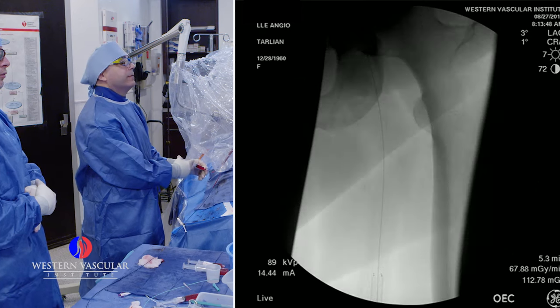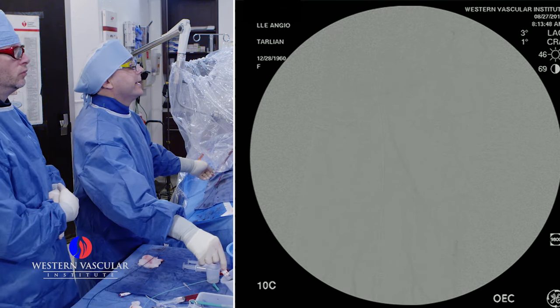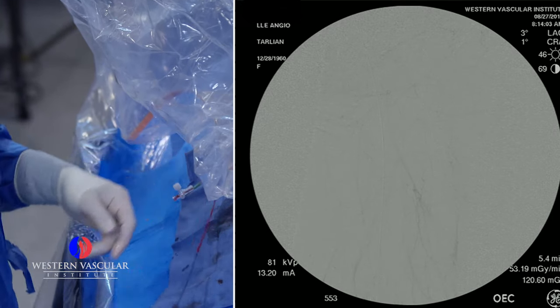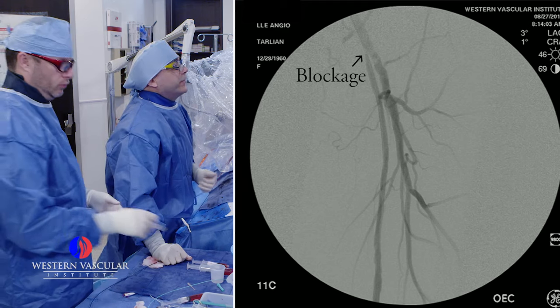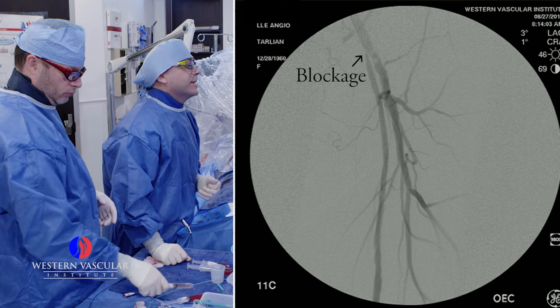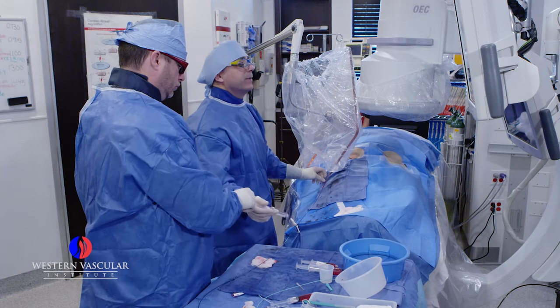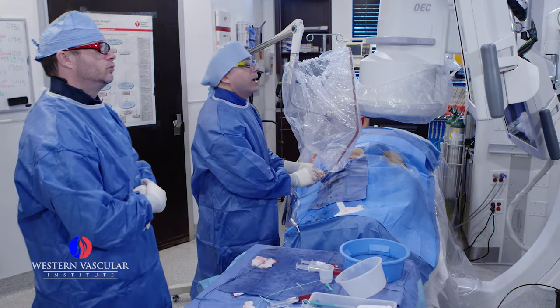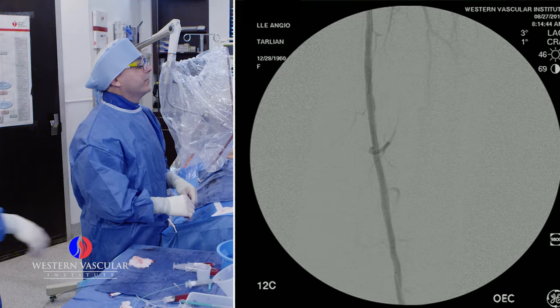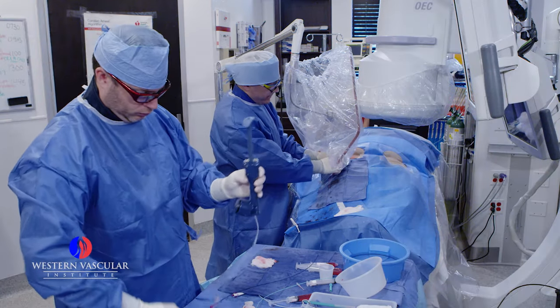Now we're going to take a picture and see what we have. You can see the flow of contrast is much quicker now. There's still a little bit of a narrowing right at the very top of the artery where the artery splits — we're going to touch that up with the balloon. The rest of the artery doesn't look too bad. We're going to check the rest of the stented artery. You can see how the artery, which is in the center of the screen, is nice and wide open. We're going to go back and treat the top part of the artery a little bit longer and see if we can get that nice and wide open as well.